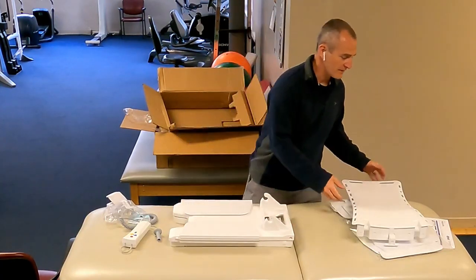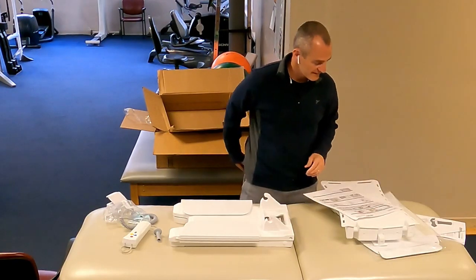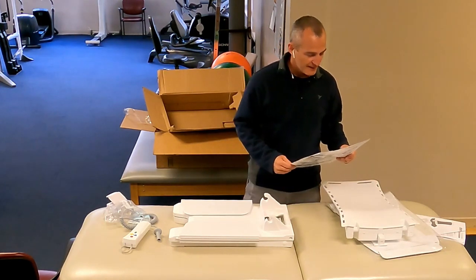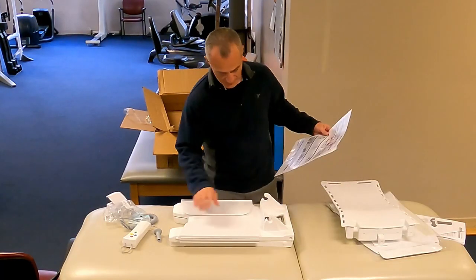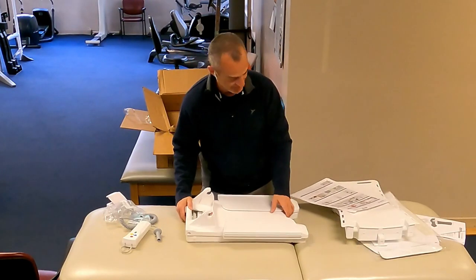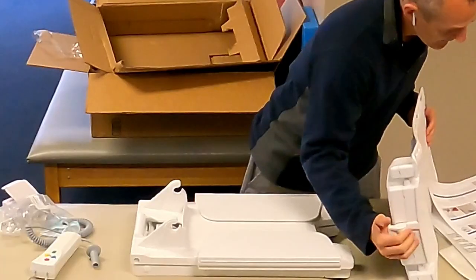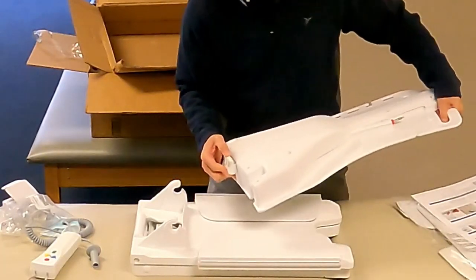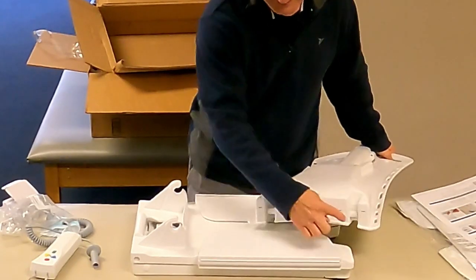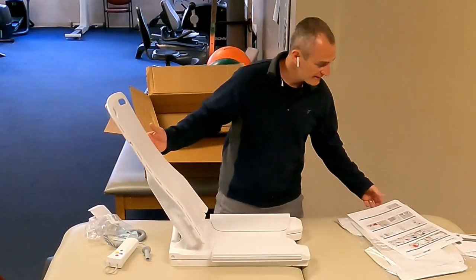Let's see what we can do about putting this all together — I'm going to use the instructions. I've never assembled a device like this before. We're looking for an area that has a little red tab. It looks like the backrest snaps into that section — these two little sections here go into these areas. That was easy.